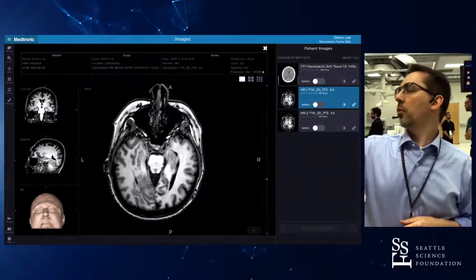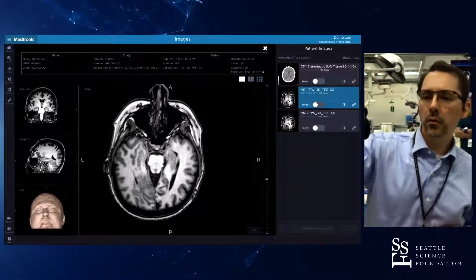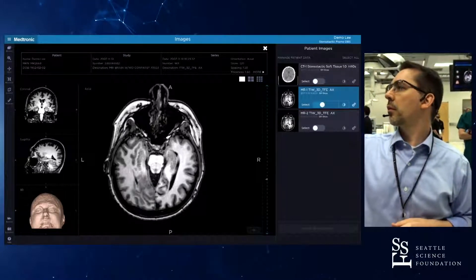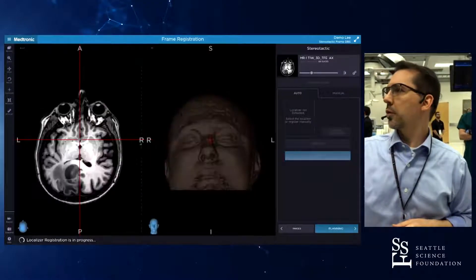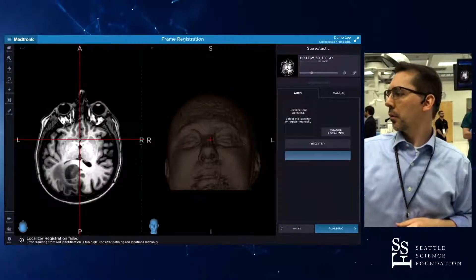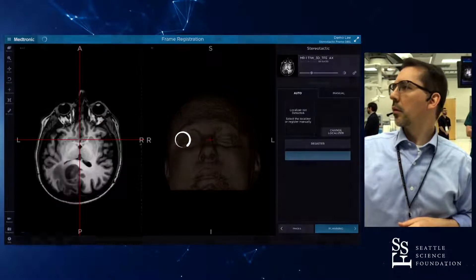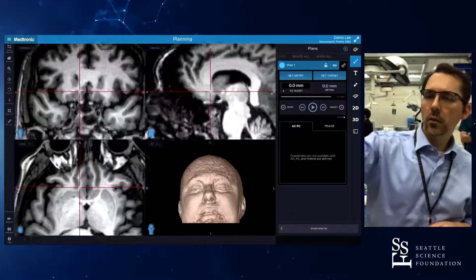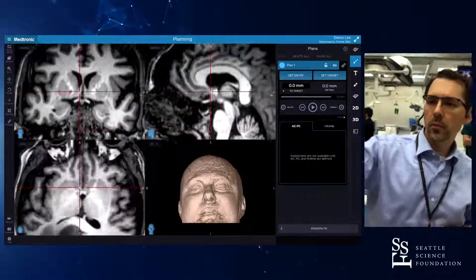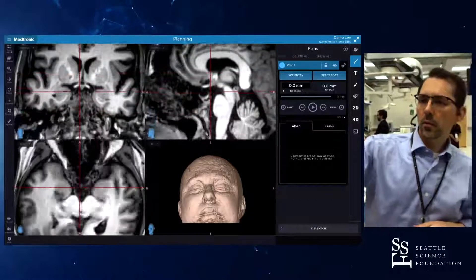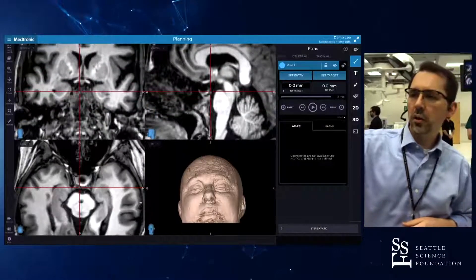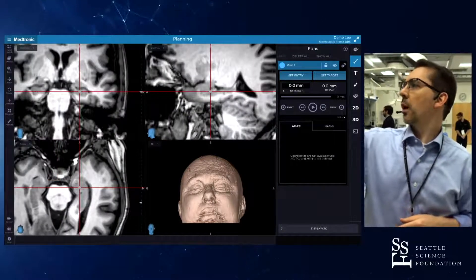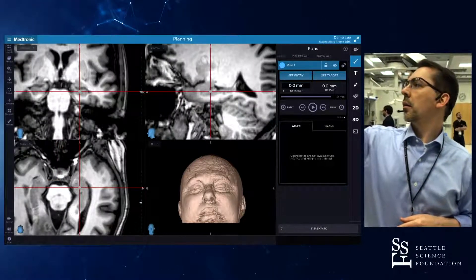Let's go into the targeting mode here. Frame registration. For a plan, we would spend a lot of time on the fine details of this, but that's the head of the hippocampus. I will create a target.